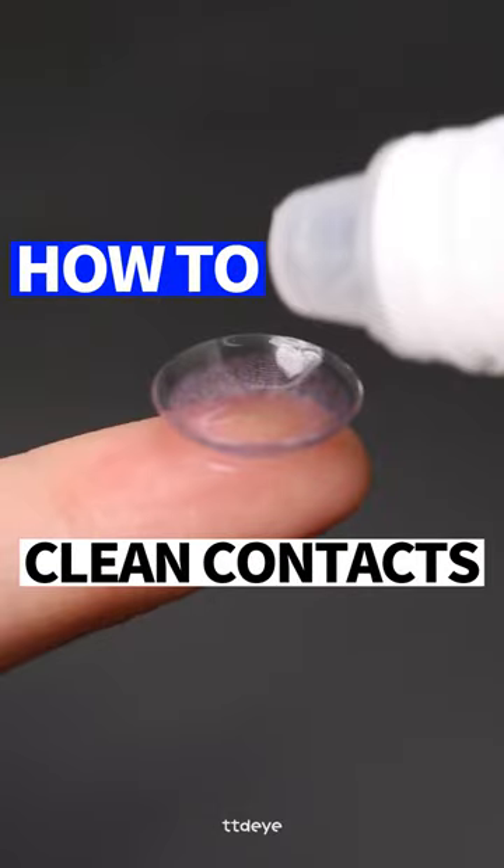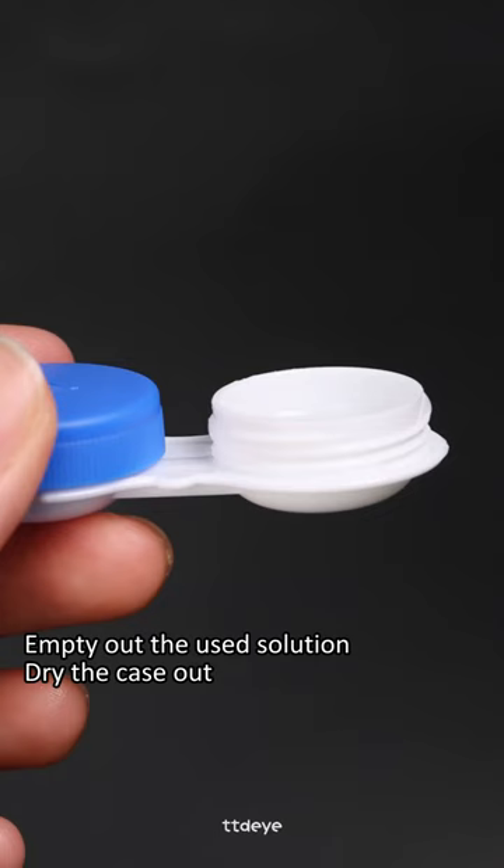How to clean your contact lenses. Before handling your contacts, make sure you wash your hands. Also empty out the used solution and dry the case out.